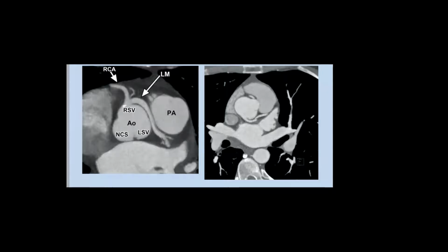But here you don't have to hypothesize because everything is before your eyes. You can see the course between the aorta and the pulmonary artery, the so-called malignant course. It might lead to sudden cardiac death. So for anomalous coronary artery disease, if you are suspecting that, I think cardiac CT is the way to go, not invasive angio.